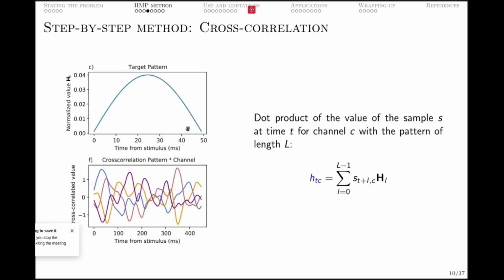So the first thing we do is take, in our case, the 4 simulated channels I showed you, blue, red, orange, and purple. We basically take this pattern and slide it through the actual EEG trial that I have displayed here. That's why you see something that is of lower frequency than the initial data, because we have basically filtered using this pattern to show at the trial level, for each electrode, how much it looked like this pattern.